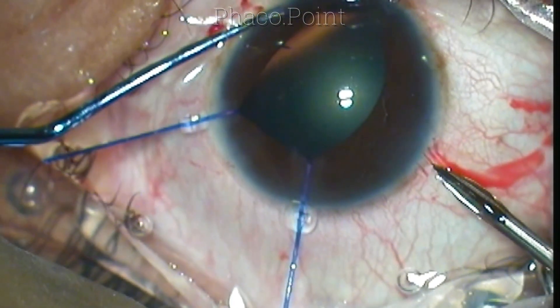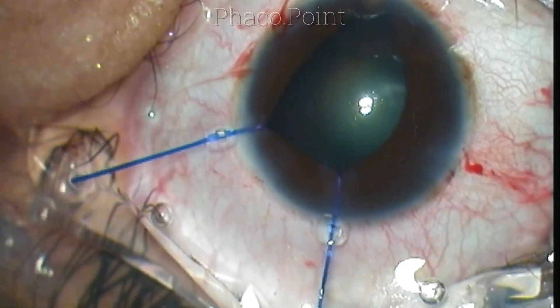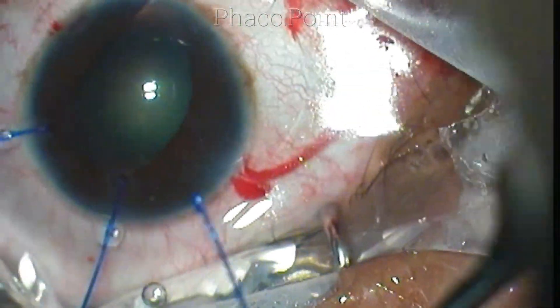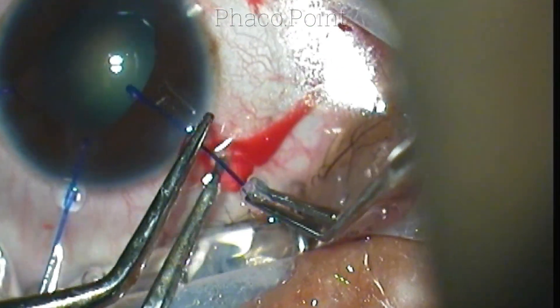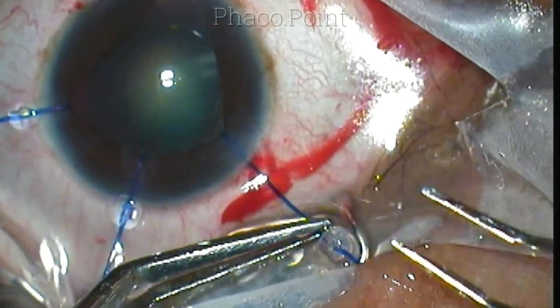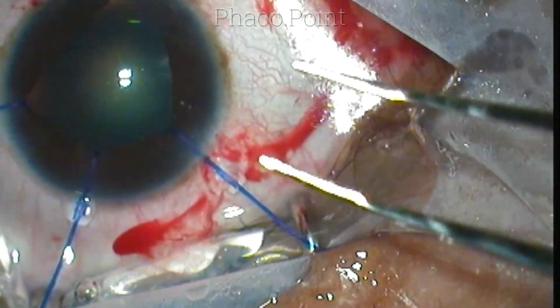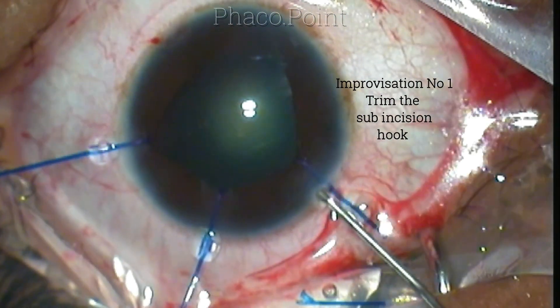Before proceeding, I decide to put in another iris hook just underneath the incision. I create a stab incision which is posterior limbal and completely avoids the clear corneal incision. Holding the flat stopper aligned with the hook, I easily maneuver the hook into place. Having placed all three iris hooks, I found one hook was a little long, so I trimmed it — and this was the first improvisation.